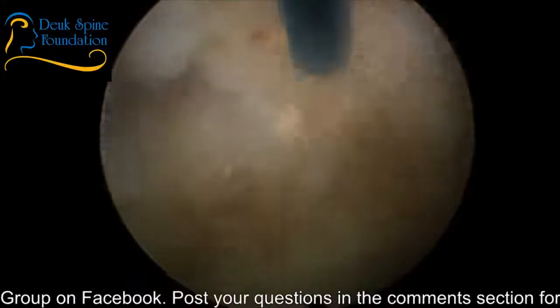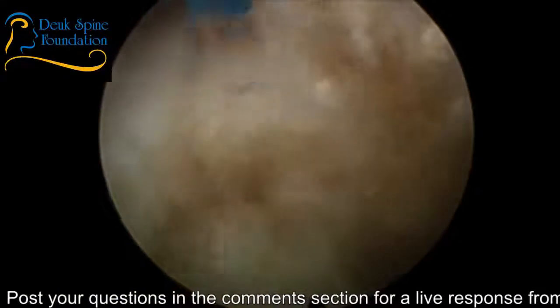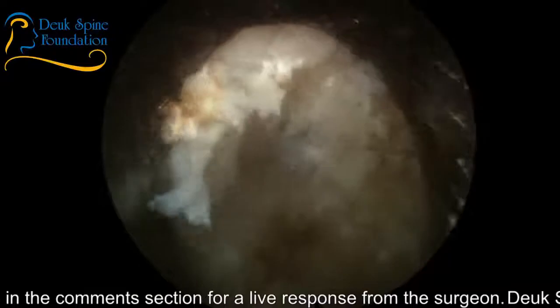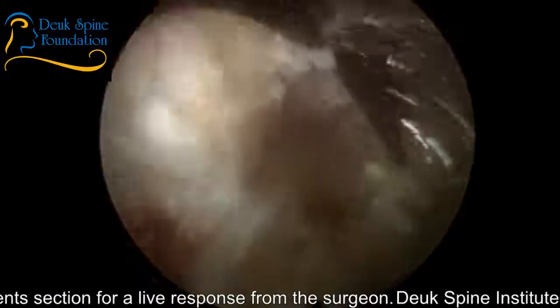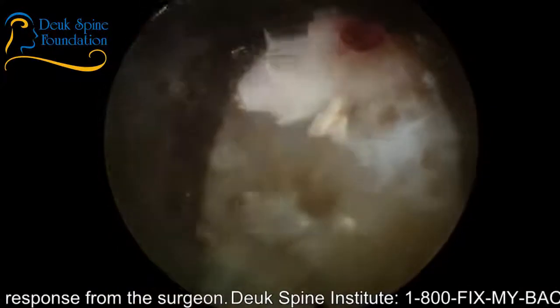Dr. Deuk, I have a question. Sure. It says, please describe the anatomy of the current scope view.